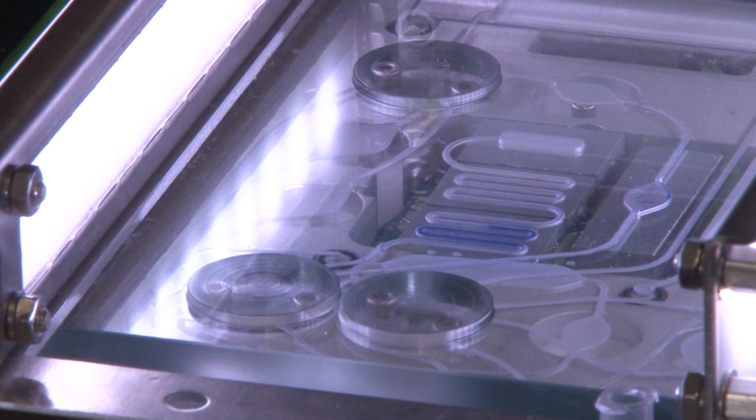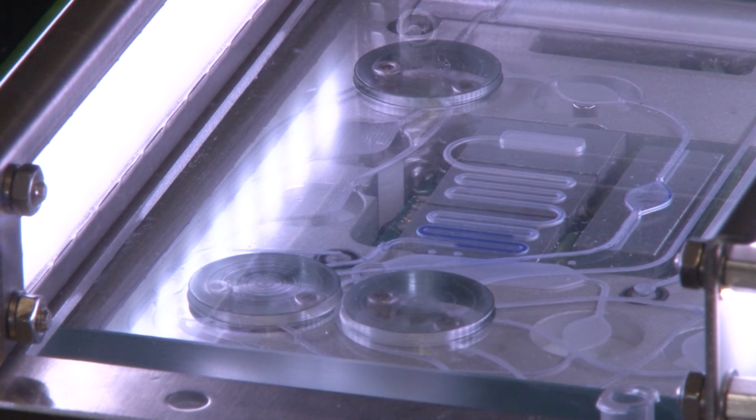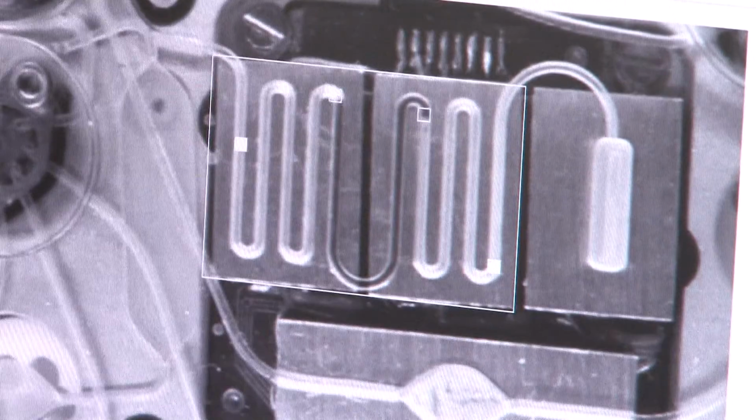The camera is used as any other component. We used exactly the same procedure we described before. We just plugged it in, we set some alarms. It's just another component. More complex, of course, but just another component.